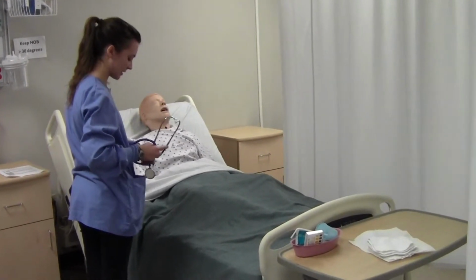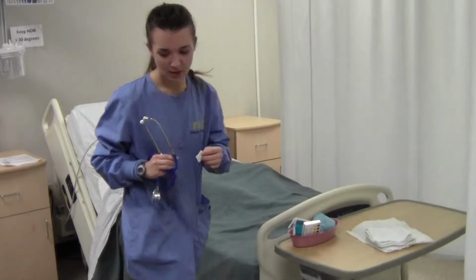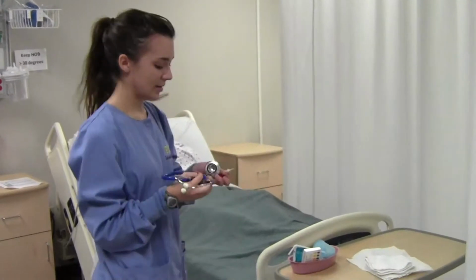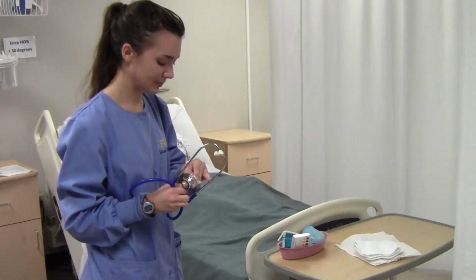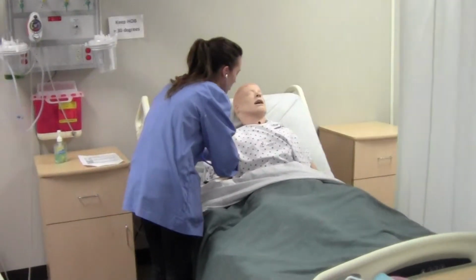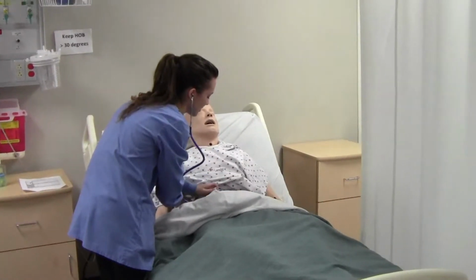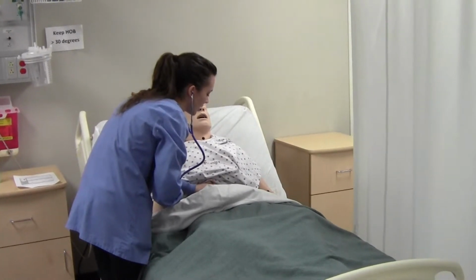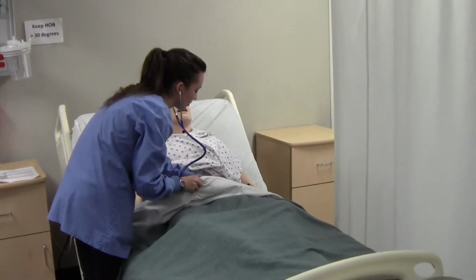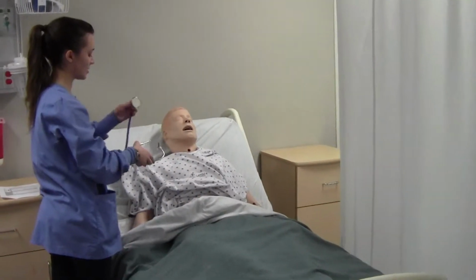I'm going to clean off my stethoscope here. Actually, I'm going to visualize, where's my trash can? I'm going to get my trash can over here. Okay. Clean off the end of my stethoscope. Normally with a bowel obstruction we would listen to each quadrant for 1 minute, but for the sake of this video I'm just going to listen to each one for a couple of seconds and simulate the minute. Okay, Mr. Templeton, I can definitely tell you have some decreased bowel sounds.